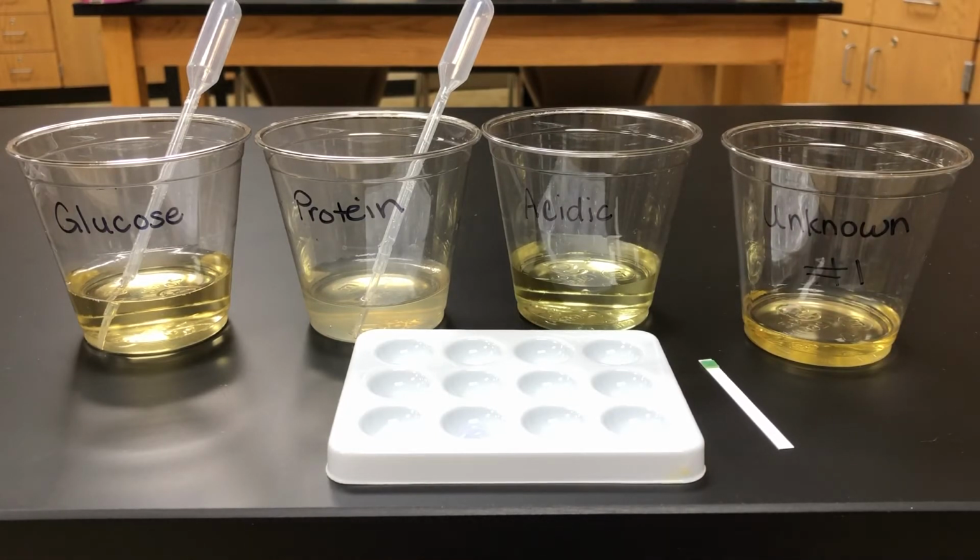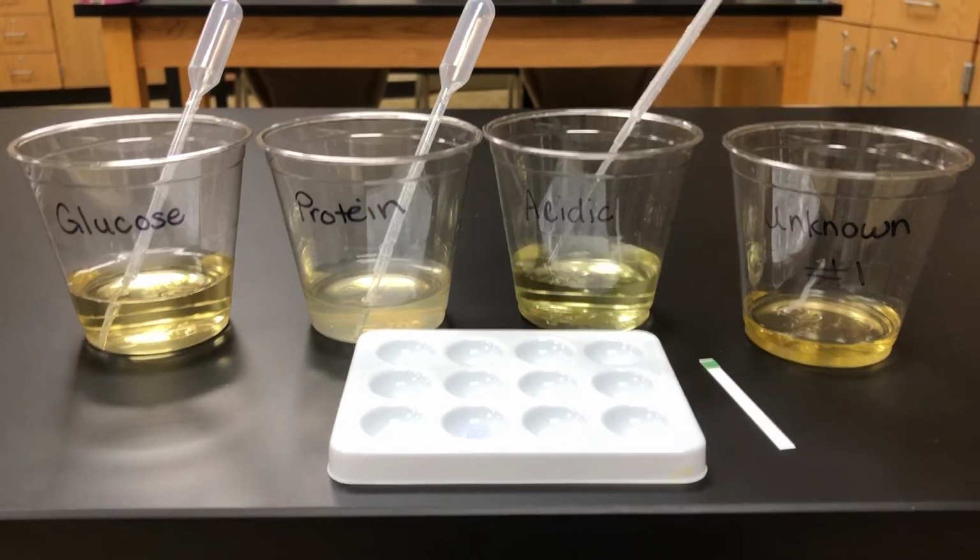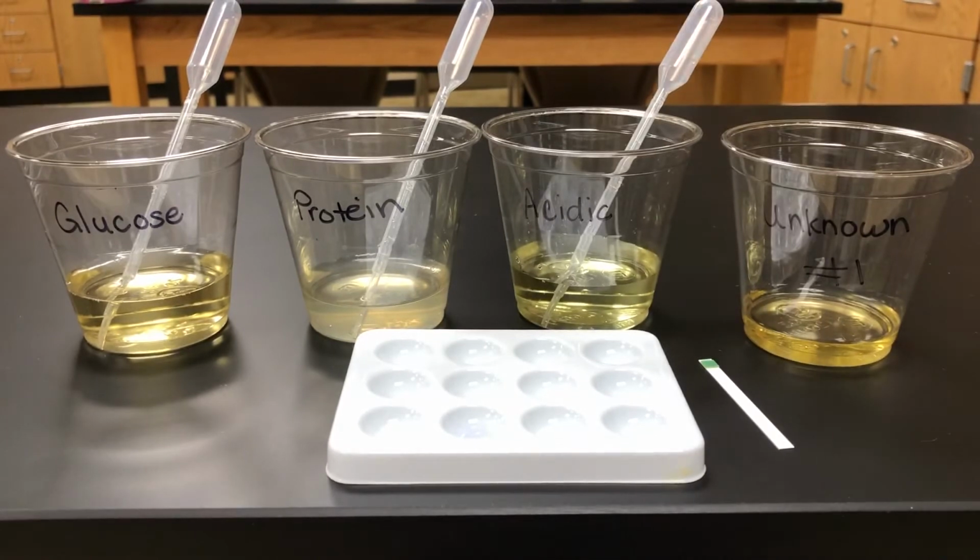All right, number 3, place approximately 5 drops of acidic urine into a clean well. So I'm grabbing a clean pipette. We've got the acid. We have our 5 drops. And then it says to test it with pH paper and record the results in the table below.